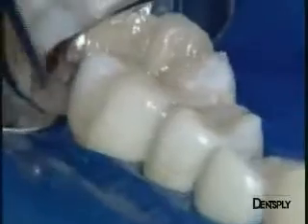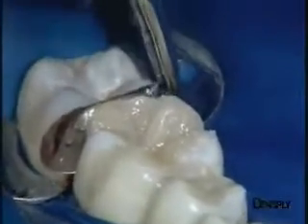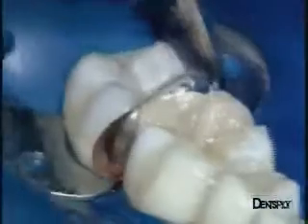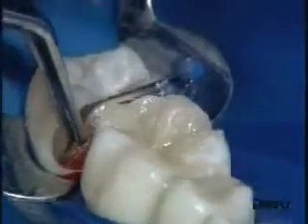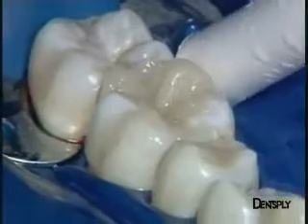At this stage, we see that the matrix is quite difficult to remove because of the quality of the contact point. It must be withdrawn carefully, and slight bleeding occurs because of its subgingival location. After a rinse, finishing can begin.